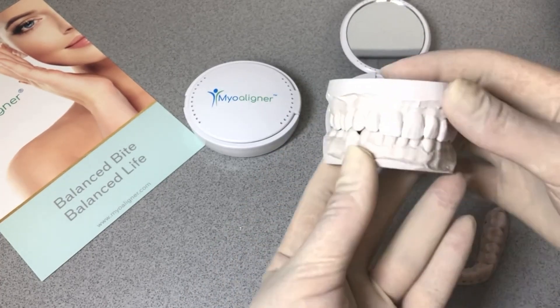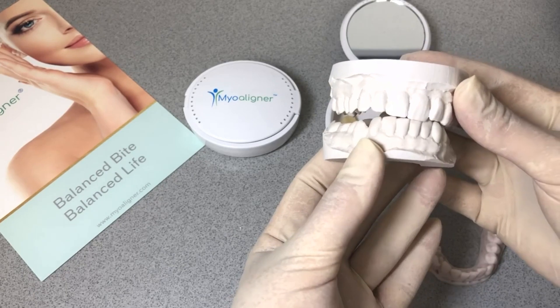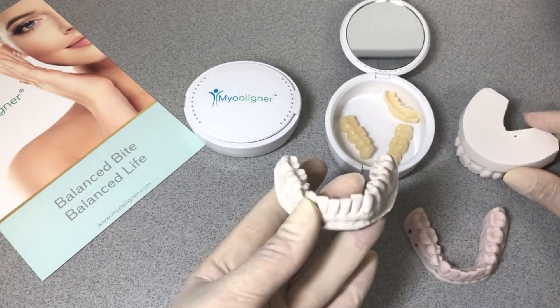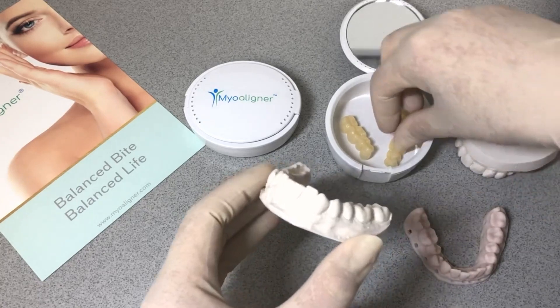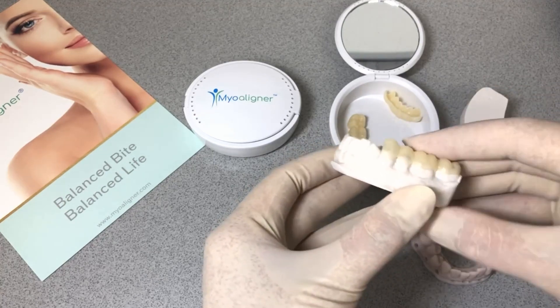A lot of our dentists will, after they relax the muscles and decide where the mandible should be, provide us with an occlusion that shows that interocclusal space. I wanted to share this design with you that is segmented and goes all the way to the gum line so the patient can chew and function with this.